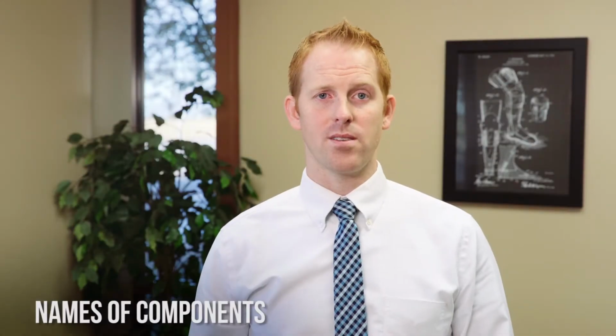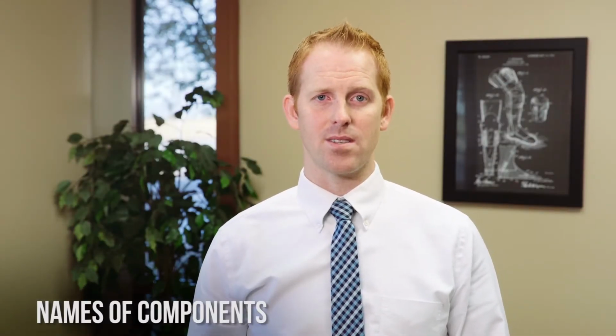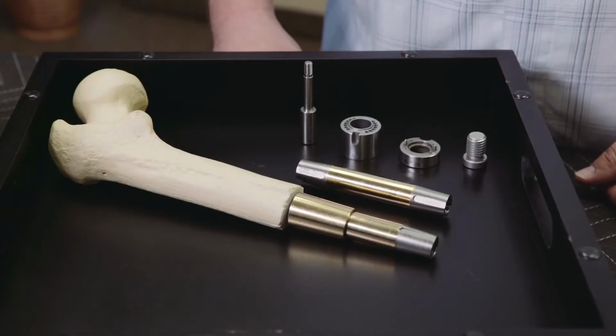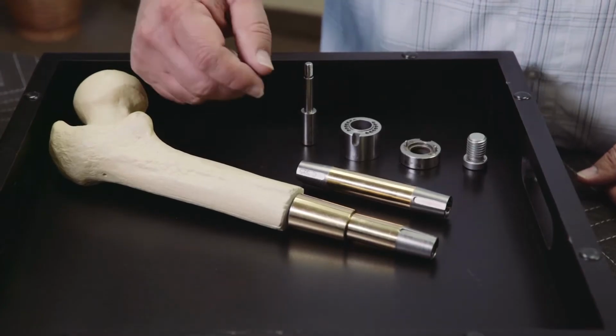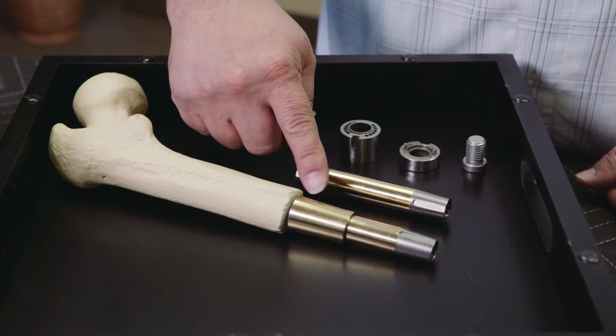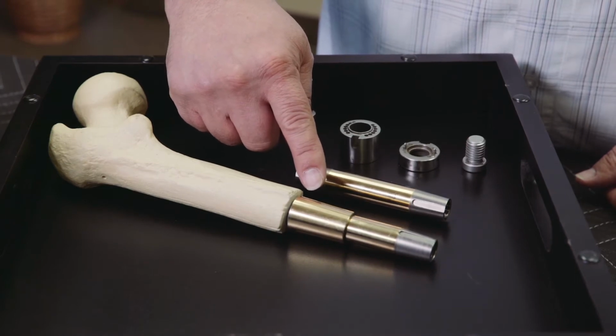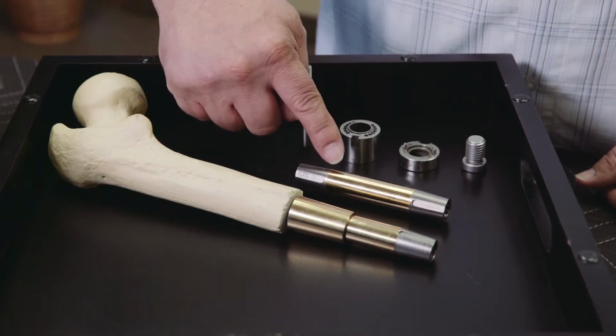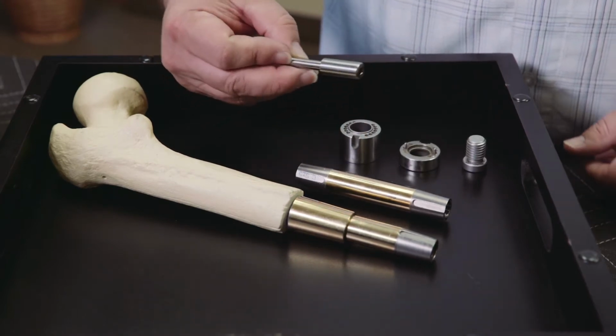All OGAP OPL systems have the same basic components, even if the design of the components might vary. The system begins with the implant, which protrudes varying amounts beyond the skin at the end of the residual limb. Pressed into the implant is the dual cone adapter. This is held in place by a press fit and a locking screw.